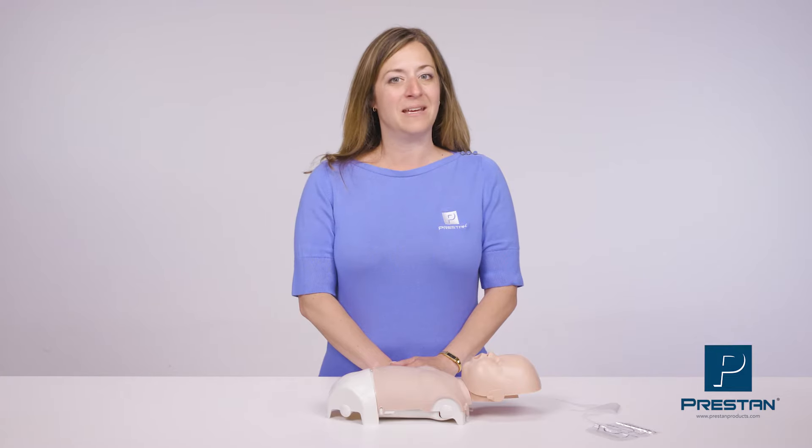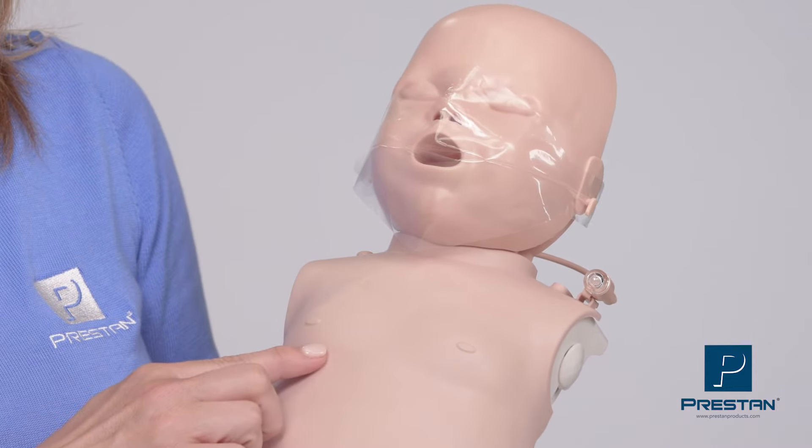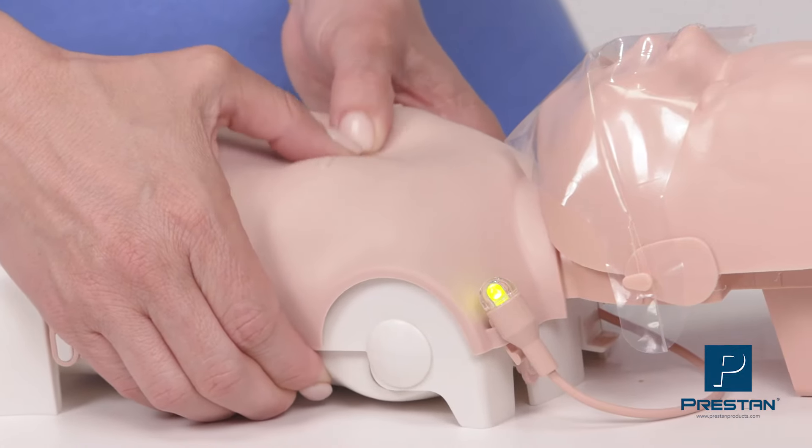As with all Preston Mannequins, the Infant Ultralight provides a realistic training experience with anatomically correct features, accurate head tilt, and visible chest rise, while providing intuitive feedback during CPR training.